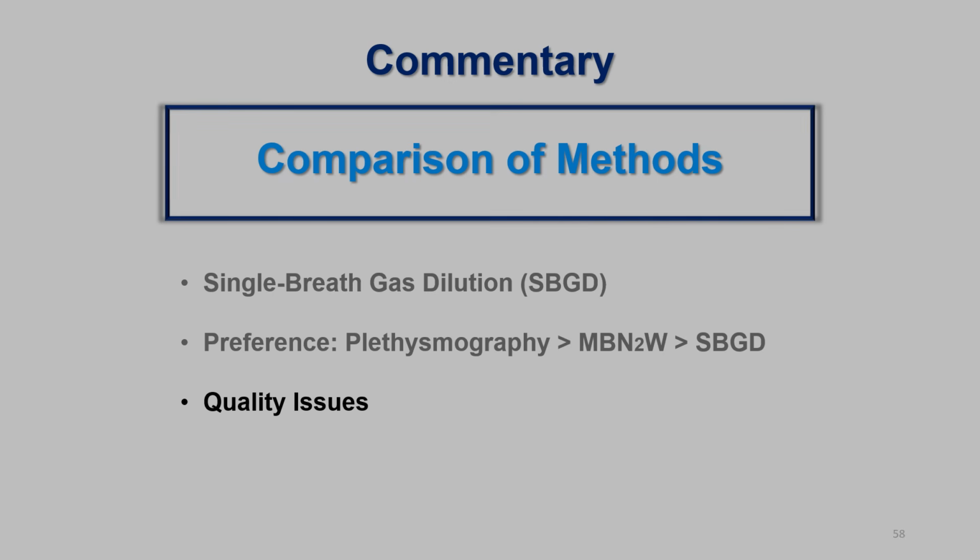The laboratorian should suspect the validity of the measurements if the alveolar volume obtained during single breath diffusing capacity testing is greater than the TLC measured with either multiple breath gas dilution or plethysmographic methods. Additionally, the technologist should investigate if multiple breath gas dilution FRC values are greater than plethysmographic VTG. Both scenarios suggest instrument or measurement error, even in individuals who do not have evidence of airflow limitation.